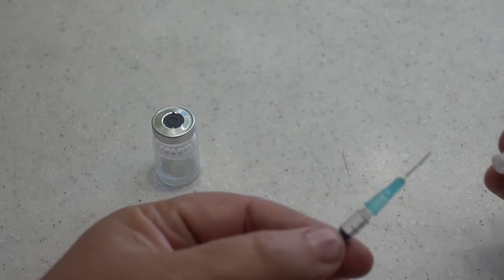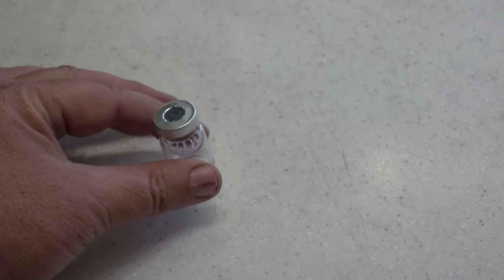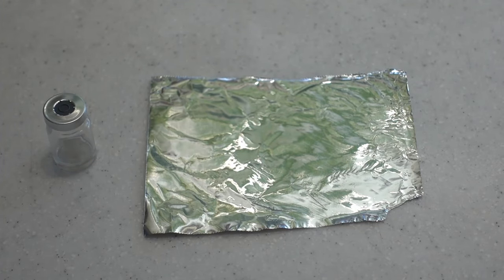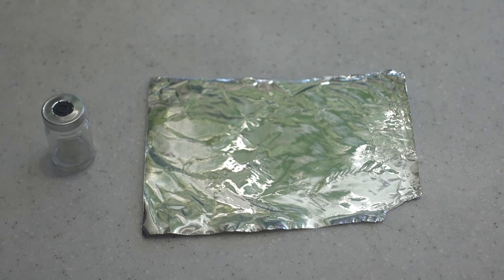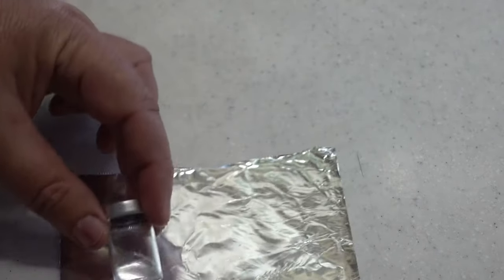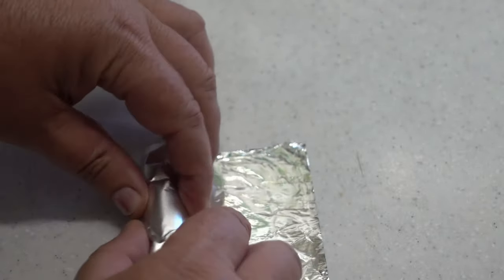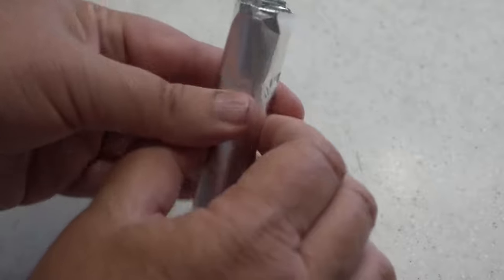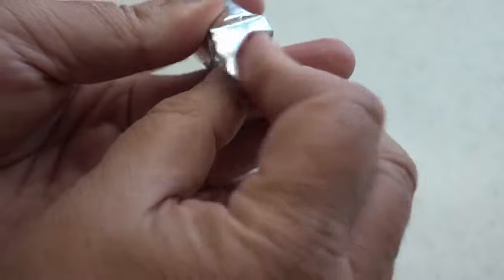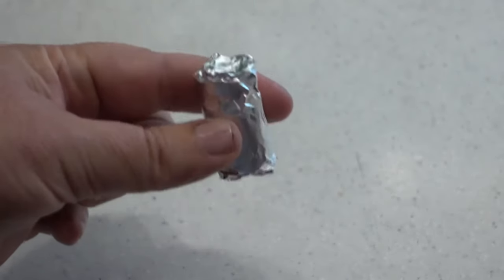Put the cap back on for safety. Set this to the side and put the 5 milliliter vial back into the refrigerator. I like to wrap up the 5 milliliter vial in aluminum foil so that we can keep it away from other items in the refrigerator. This keeps it nice and sanitary.